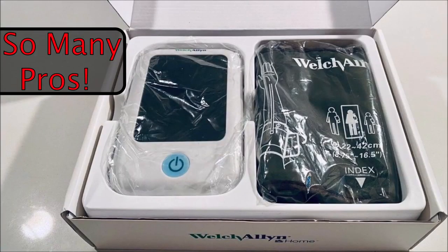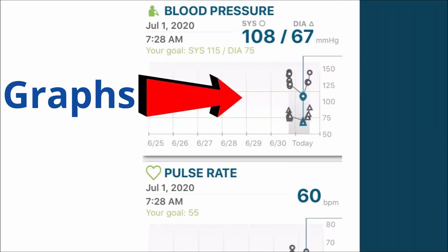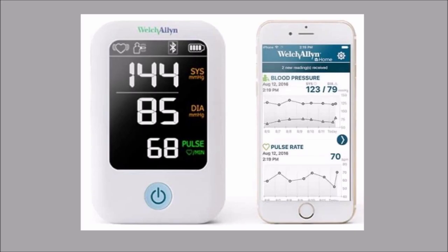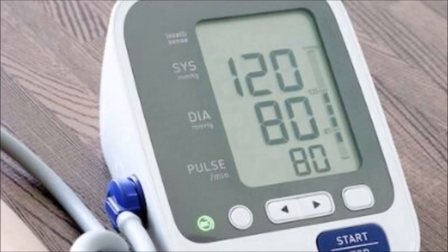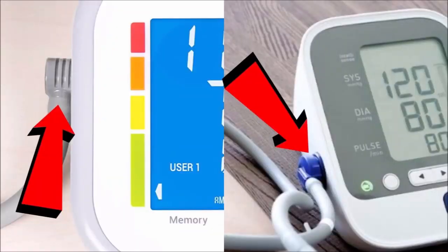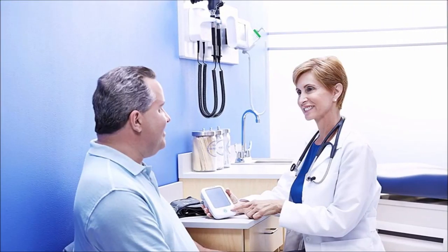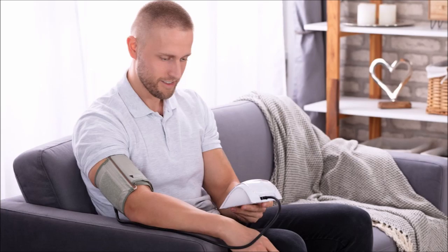That being said, there are so many pluses. The app will store all your readings and keep them in lists, graphs, and generate reports which you can email to yourself or your doctor. The display has a dark background with easy-to-read large numbers with high contrast — not that gray-on-gray you see so much with other monitors. It's easy to use, has quality parts like the metal air hose connector while others are made of plastic. But the most important are the quality and accuracy of the device, which is why I highly recommend this monitor to anyone. It makes no sense to monitor your blood pressure at home if it's not going to give accurate readings.